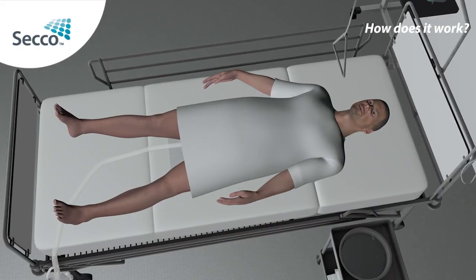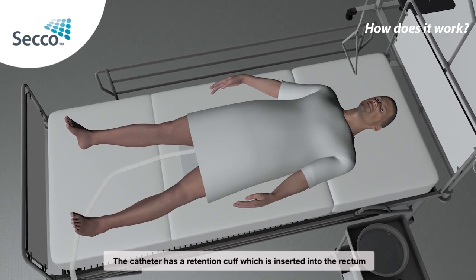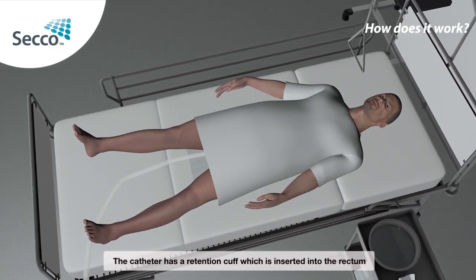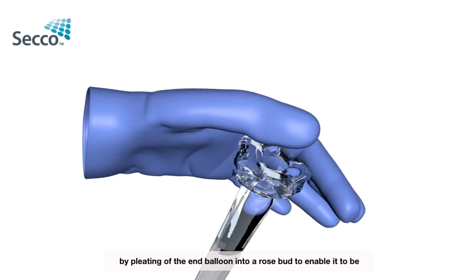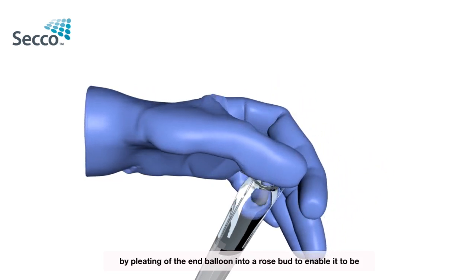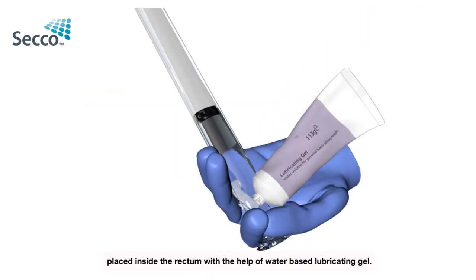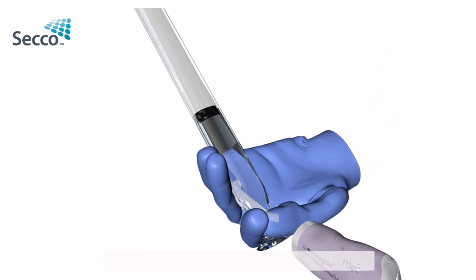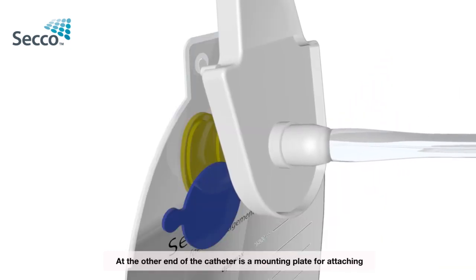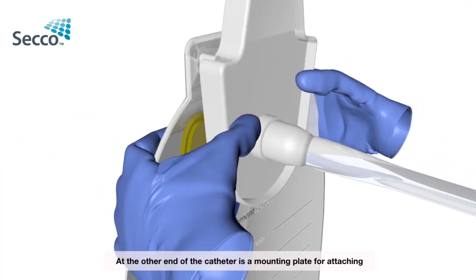How does it work? The catheter has a retention cuff which is inserted into the rectum through the anus by pleating off the end balloon into a rosebud, to enable it to be placed inside the rectum with the help of water-based lubricating gel. At the other end of the catheter is a mounting plate for attaching the collection bag.